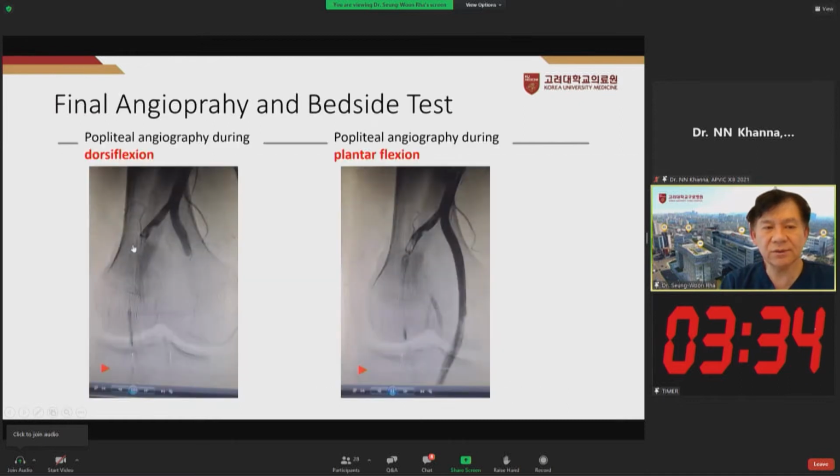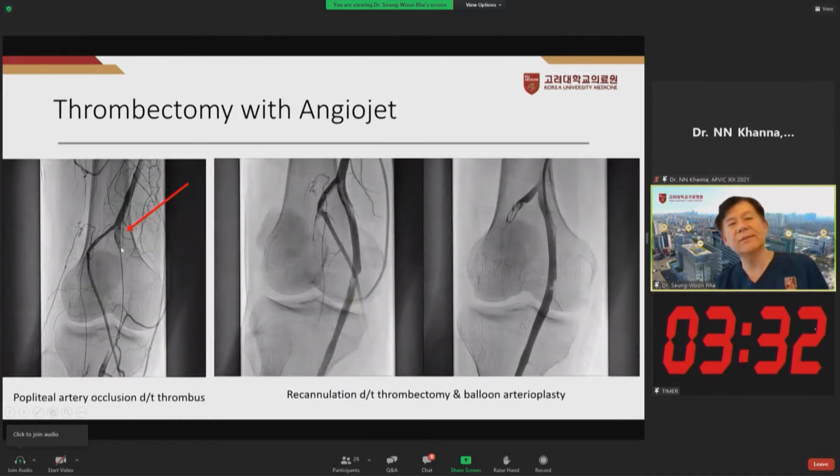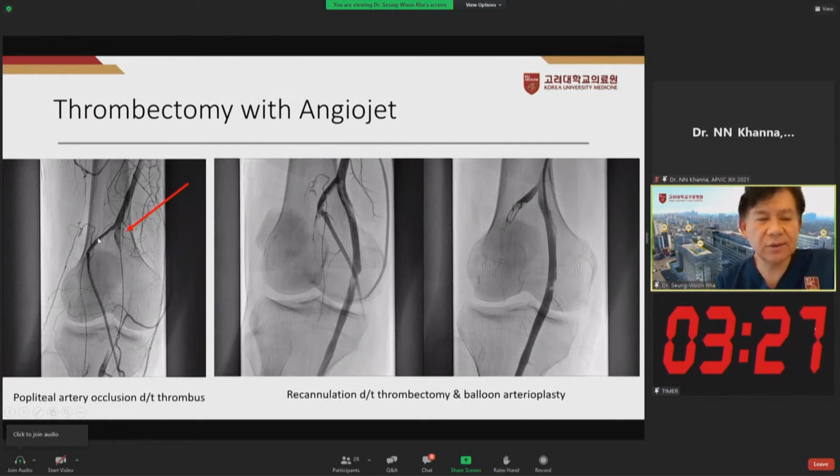So I decided to do thrombotic component management by an endovascular approach. With TPA infiltration and thrombosuction done mechanically by protocol, just one thrombosuction achieved a nice result. Then with just additional balloon angioplasty and focal thrombosuction by catheter embolectomy, without aggressive management, a good result was achieved.